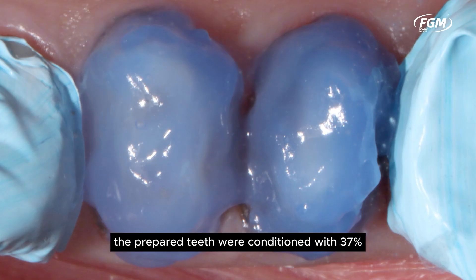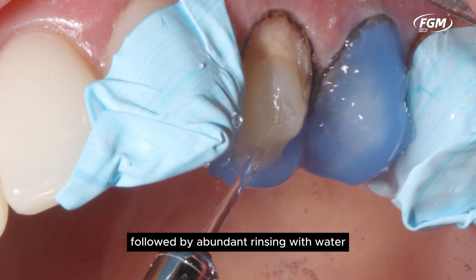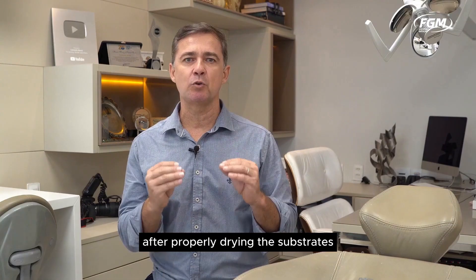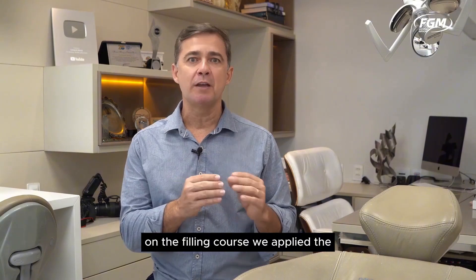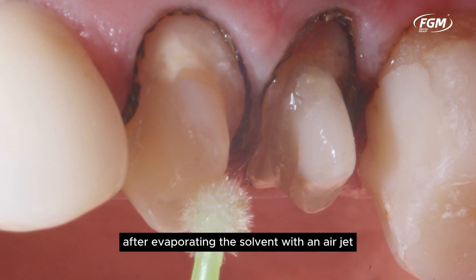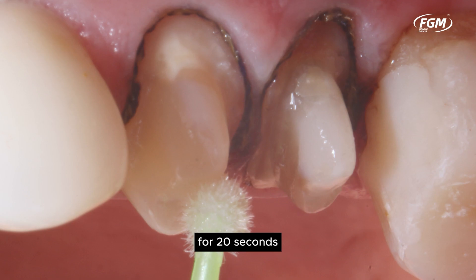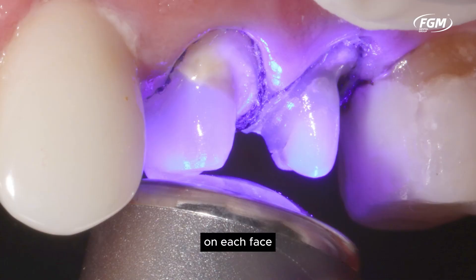The prepared teeth were conditioned with 37% phosphoric acid for 15 seconds, followed by abundant rinsing with water. After properly drying the substrates and applying ProCyl Silan for two minutes on the filling cores, we applied the Ambar Universal APS Plus adhesive actively for 30 seconds. After evaporating the solvent with an air jet for 20 seconds, we photopolymerized the adhesive for 40 seconds on each face.